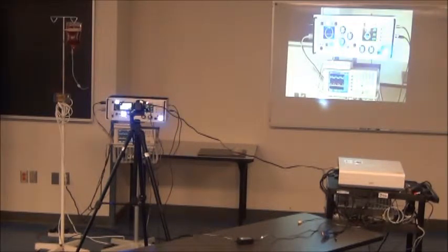Right now on the display, all of our outputs are within a range of plus or minus 3 millimeters of mercury. This is specified in the outline, so we have to adhere to these standards. But in the end, we were able to design an output that is within 0. So it's accurate. It's to do with the programming as well. We'll talk about that later.